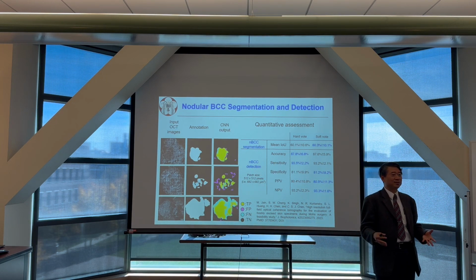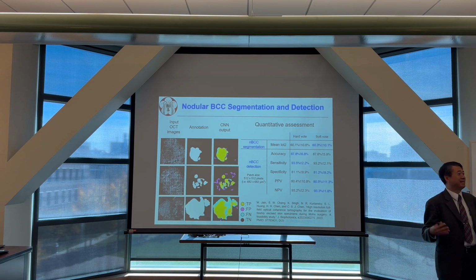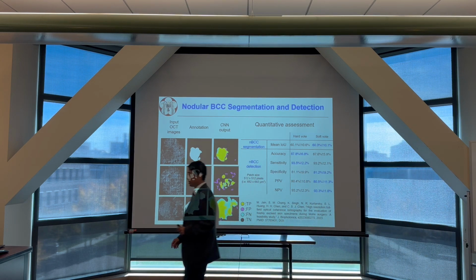gold standard. All the physicians, they know HE, they believe HE, but these days they don't believe OCT. So I think it will still take a long time for the physicians to accept OCT. But for HE stain, let me show one of the HE stain images.